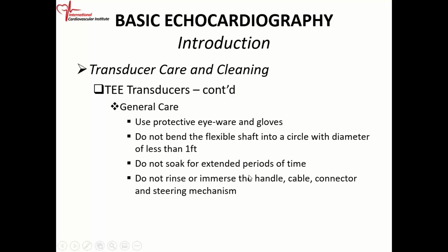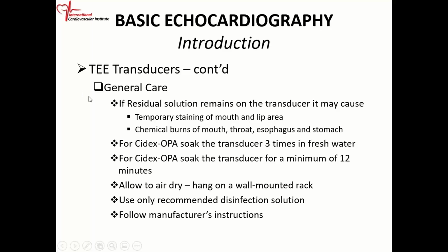You have to immerse it in the cleaning solution, and there are side effects. When you go to different offices, you can look and see what cleaning solution they use. There are usually some Cidex products. You have to make sure that you clean the transesophageal transducer properly.